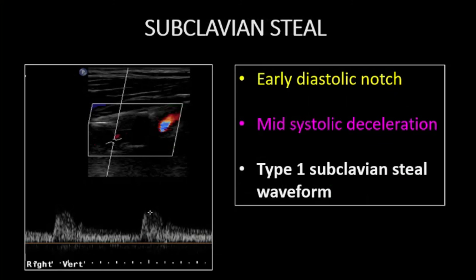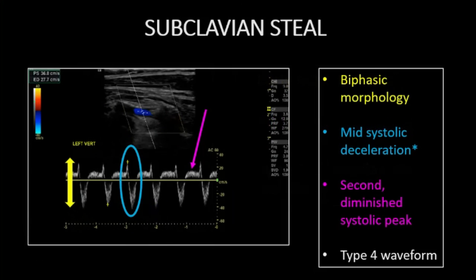Moving centrally in the body, we're going to look at progressive ultrasound changes with progression of subclavian arterial disease. This is an early imaging manifestation of subclavian steal phenomenon. The more prominent waveform abnormality is an early diastolic notch. Harder to see but still present is a mid-systolic deceleration — a type 1 subclavian steal waveform. This spectral doppler tracing of a left vertebral artery shows an atypical biphasic morphology with a key mid-systolic deceleration, representing a sudden sharp flow deceleration during peak systolic velocity reflecting a drop in pressure at the stenotic segment of the subclavian artery. A second but diminished systolic peak will subsequently be seen, representing a type 4 waveform.